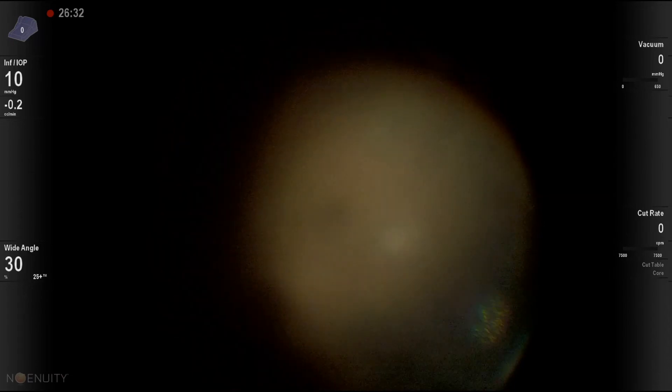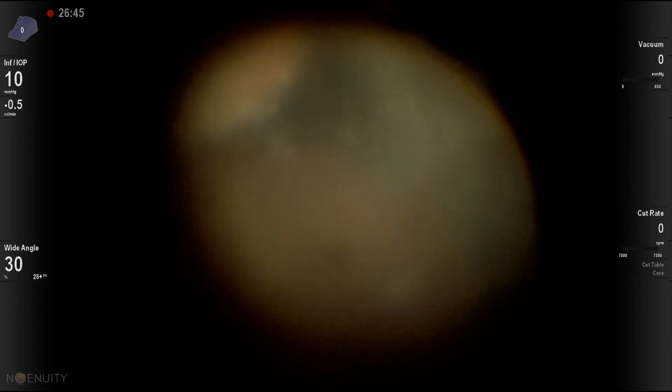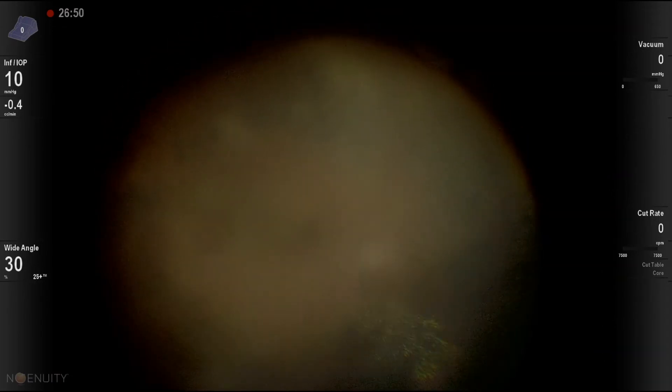Now we're finished with peripheral indentation to look at what's happening in the periphery. You can see some infiltrates there. Usually that resolves after intravitreal antibiotic treatment.